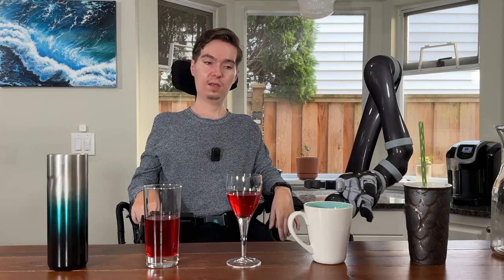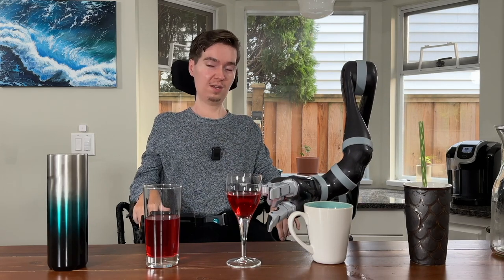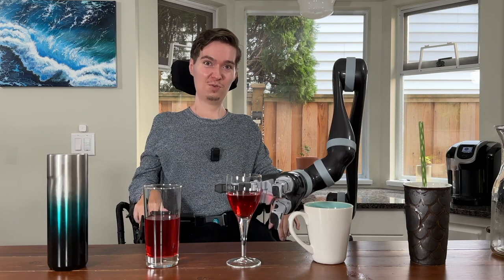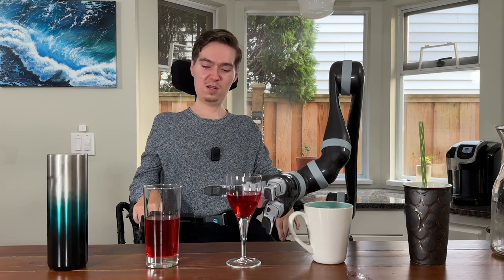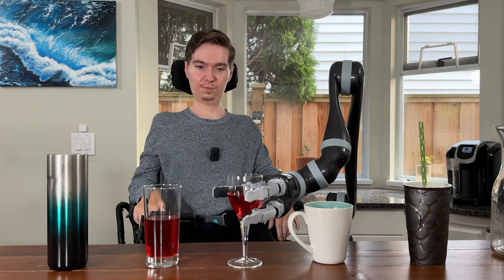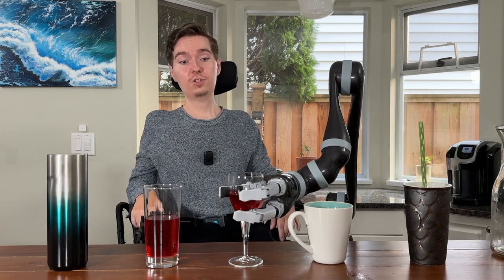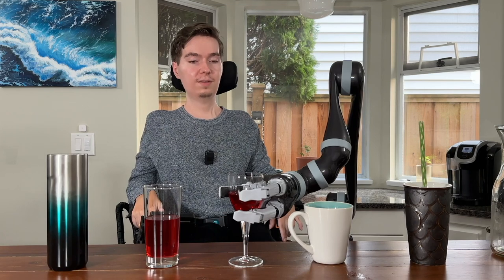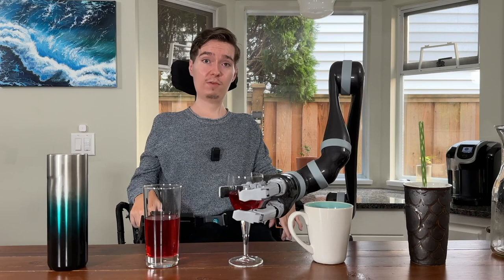Now let's try something a little bit more complicated, but not too complicated — this wine cup. I'll just remind you that this is herbal tea and not red wine, but for me we're just drinking some herbal tea. So I'm just going to grab this very gently, and again, we're going to want to make sure that the cup is right in Jayco's palm. This allows Jayco's fingers to get a really good grip so that you're not dropping your favorite beverage all over yourself.